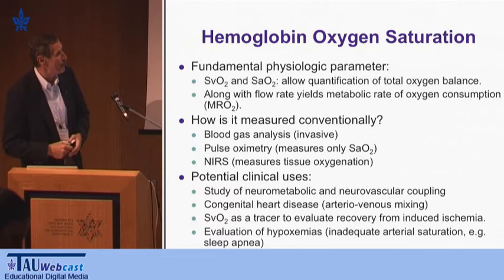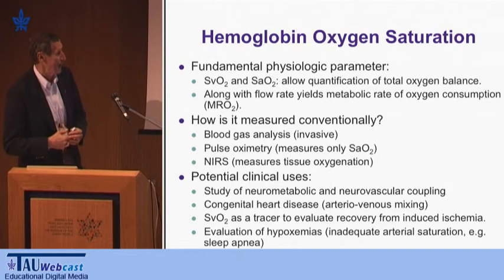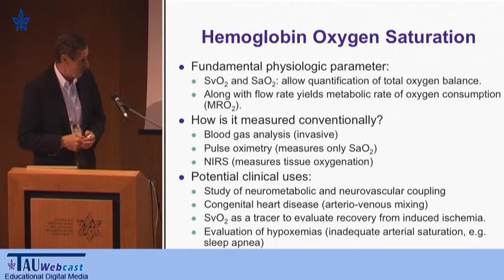SvO2 can be used as a tracer, for example, to study the response to induced ischemia. We can also evaluate hypoxemia. And by hypoxemia, we mean inadequate arterial saturation, as it occurs, for example, in sleep apnea.